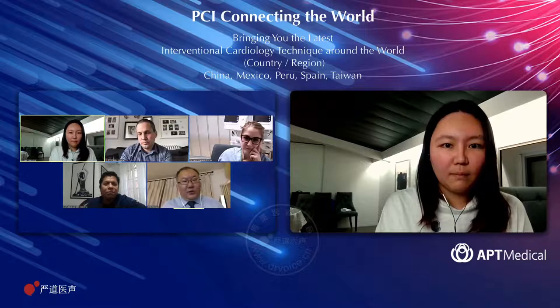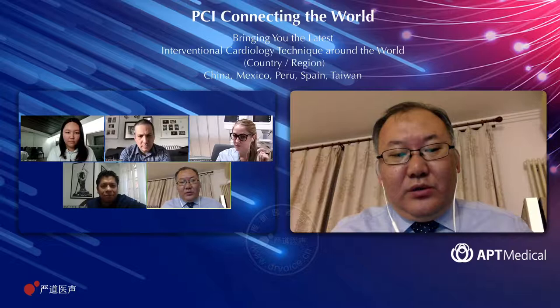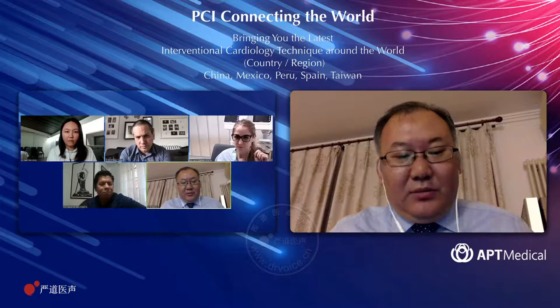Okay. Thank you, Dr. Liang, a very great job. I have only one suggestion for the ambiguous proximal CTO cap: using a Gaia 2 to puncture the ambiguous proximal cap is sometimes dangerous. Usually we use IVUS to find where the proximal cap is, then choose the right wire and make the right tip curve, and that will be better. But you really did a very good job.